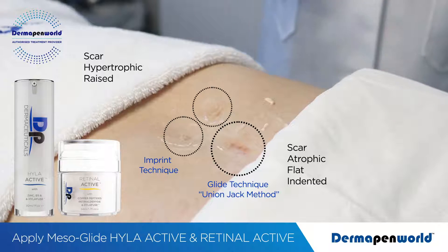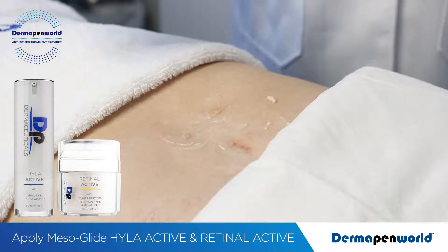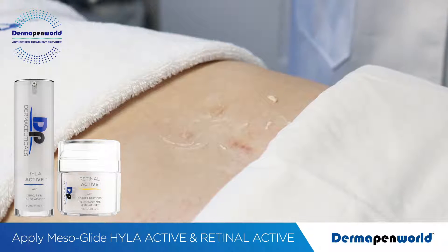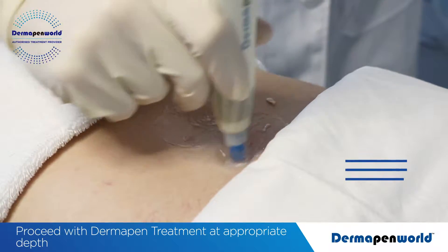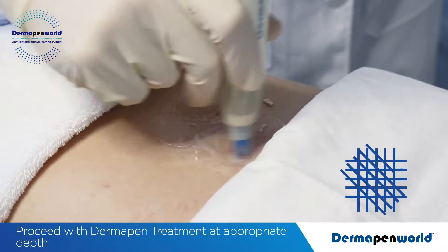First, to treat our top scar using our glide technique, turn the Dermapen 4 up to full speed. I'm at 1.75mm. Pass in four directions: horizontal, vertical, diagonal 1, diagonal 2.